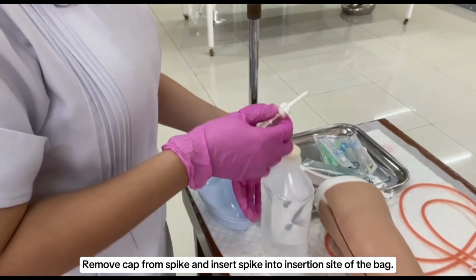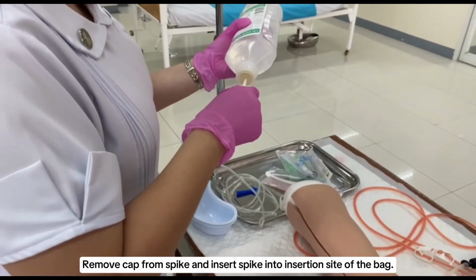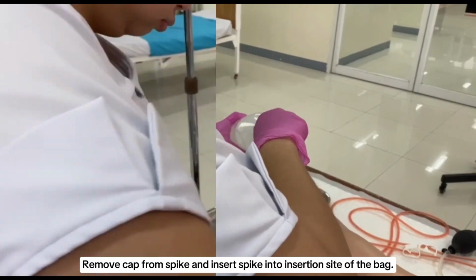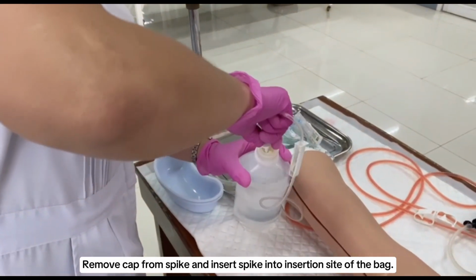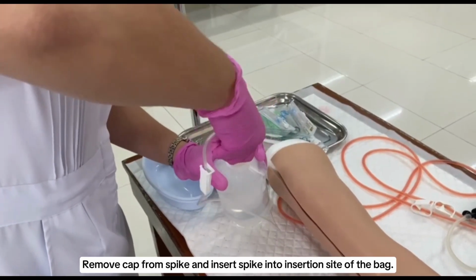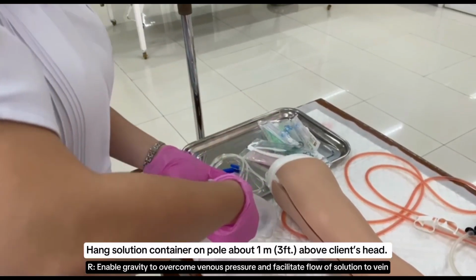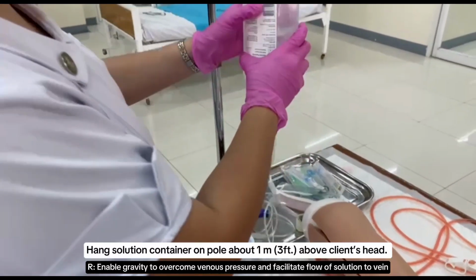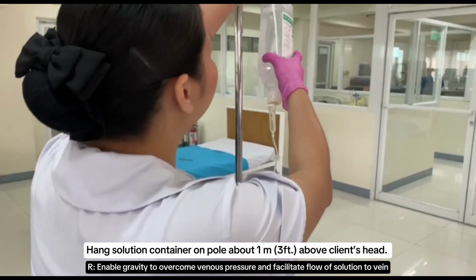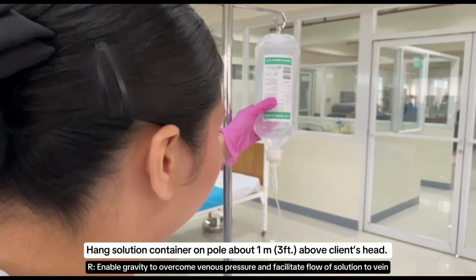Remove the cap from the spike and insert the spike into the insertion site of the bag. Hang the solution container on a pole about 1 meter or 3 feet above the client's head. It is done to enable gravity to overcome venous pressure and facilitate the flow of solution to the vein.